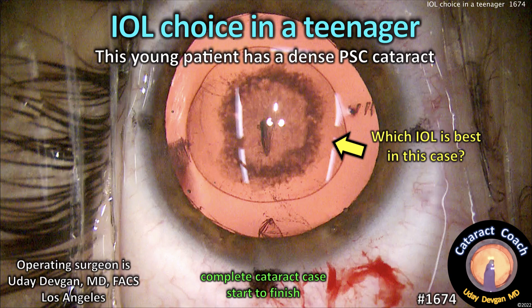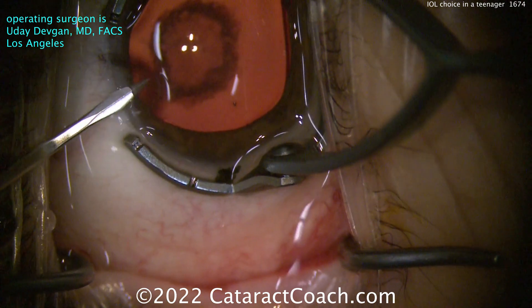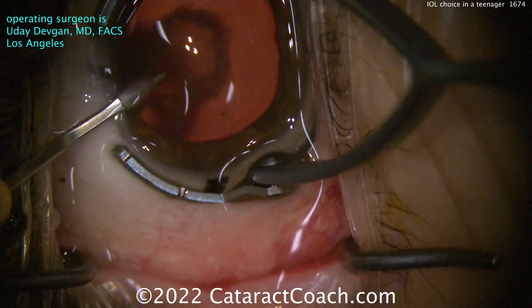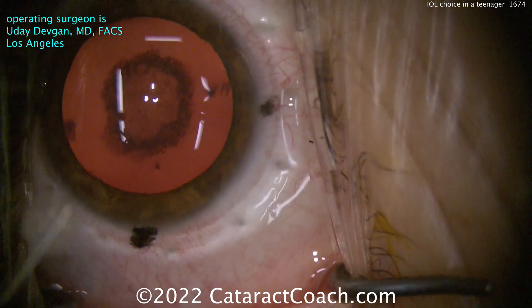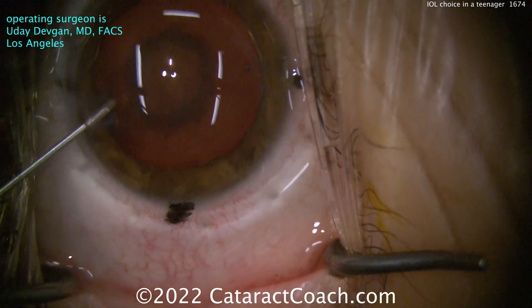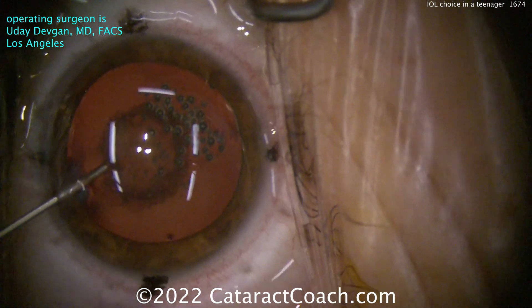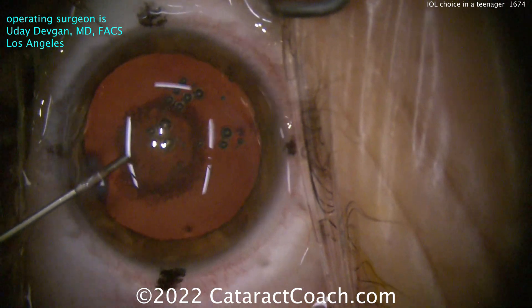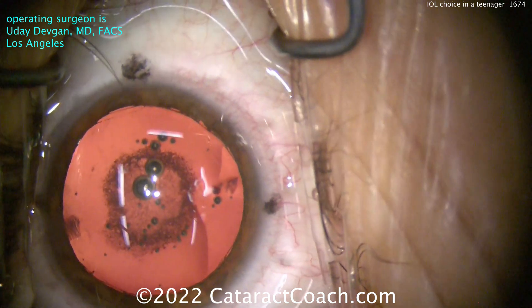CataractCoach.com — IOL choice in a teenager. We have a very young patient with a dense posterior subcapsular cataract. Why is the video so dim? The patient is old enough to have just some sedation, no general anesthesia needed. The patient's having a hard time looking at the light, so we dim it very low. This is our anesthetic: preservative-free lidocaine cut 50-50 with BSS, which will help the patient tolerate the light better.